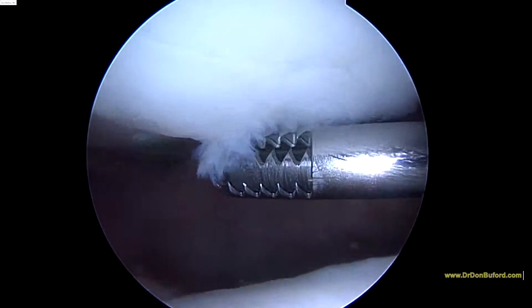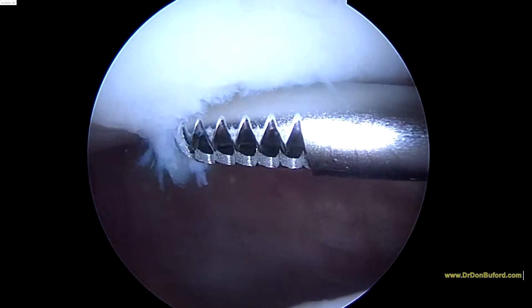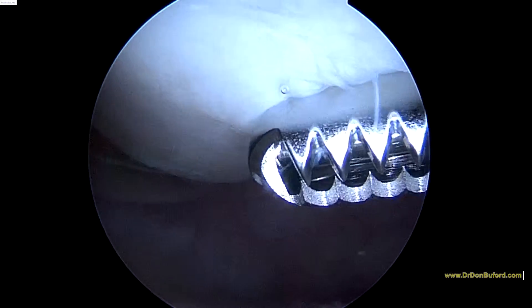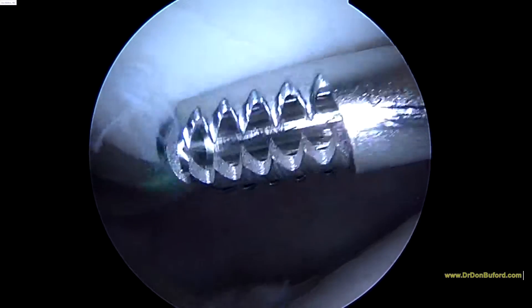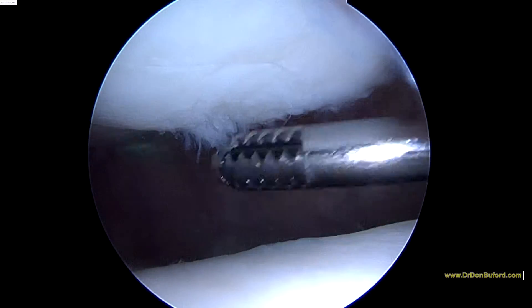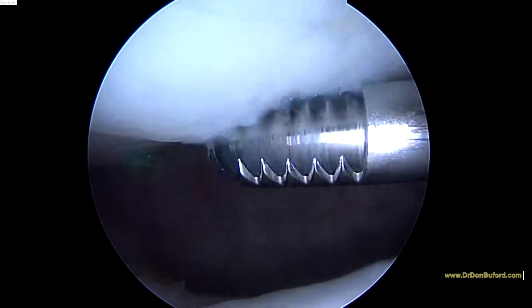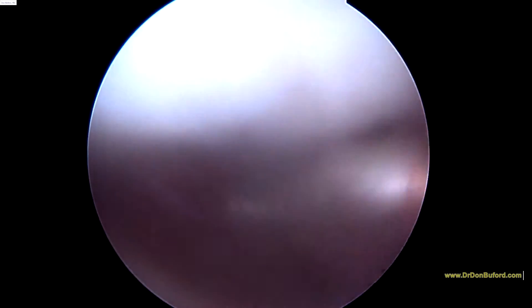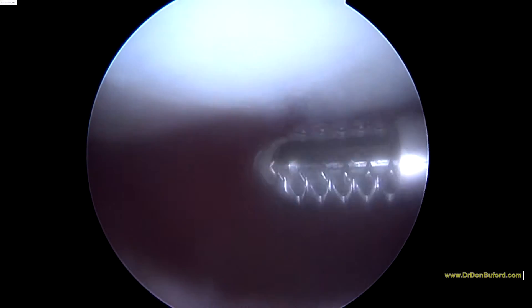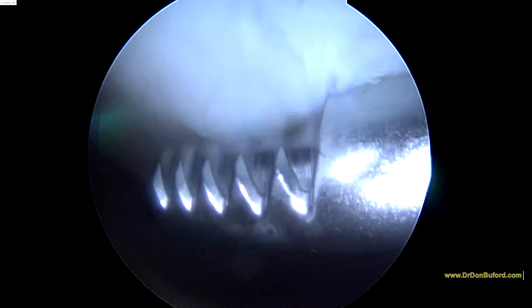Here's the area underneath the patella we were concerned about. You can see how this cartilage here is hanging down and a little bit frayed. You can see evidence of some softening of the cartilage here laterally as well. So we're going to go ahead and start the shaver. We don't want to dig into this area — we just want to remove anything that's clearly loose. We don't want to remove any cartilage, and then we're going to do our bone marrow aspirate injection to try and promote or stimulate a healing response here.